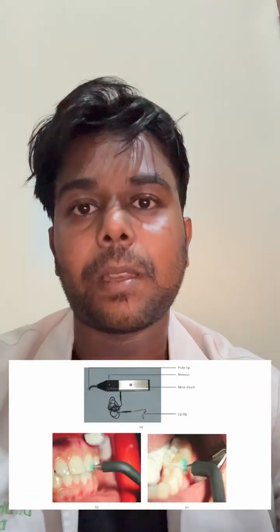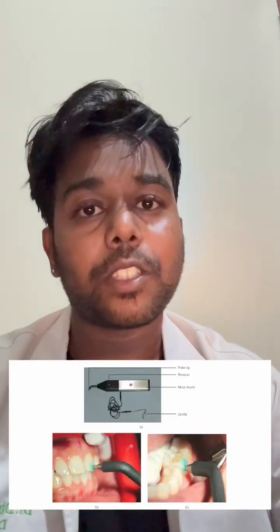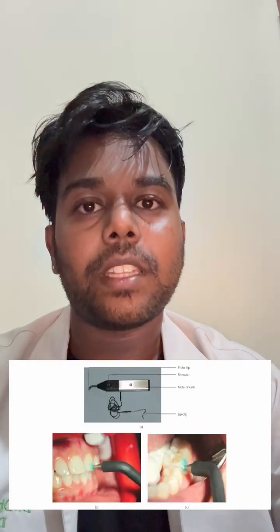And in the electric pulp test, usually a mild electric current is used to stimulate the pulp, and the patient signals for a tingling and warm sensation. A positive response indicates a vital pulp, while no response indicates a necrotic tooth. However, EPT detects only the nerve response and not the true vascularity, so the results should be interpreted cautiously.